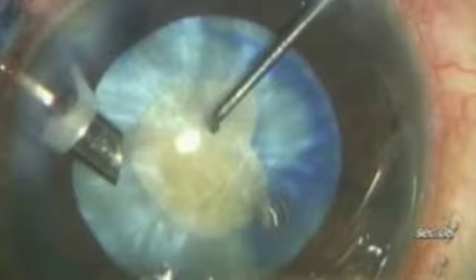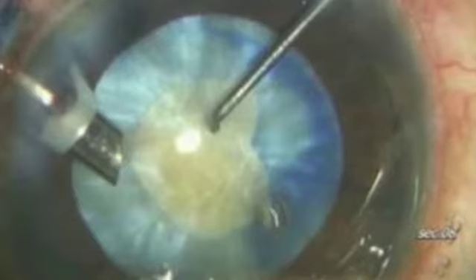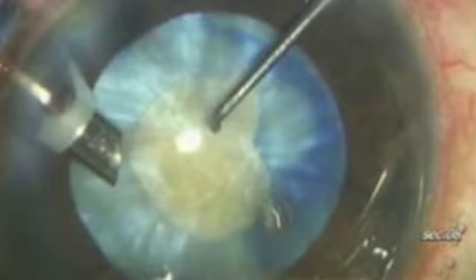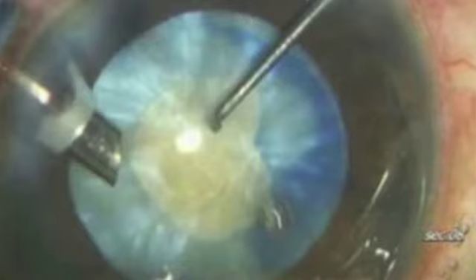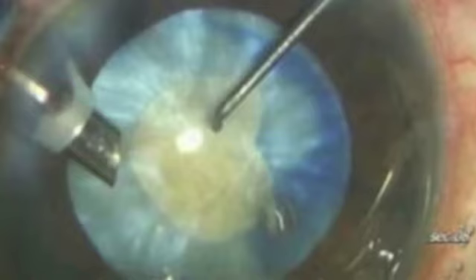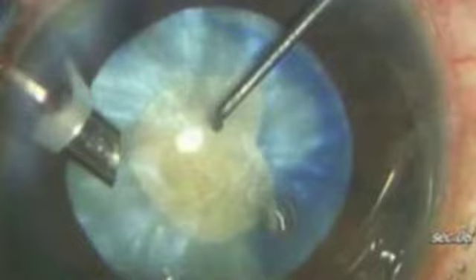I made this video to show you the difference between traditional cataract surgery and cataract surgery using the computer-guided femtosecond laser. In this still photograph I've chosen, you can see a dense white cataract having surgery. The blue is the anterior capsule, and it's been stained with a blue dye to make it easier to visualize. The art of the surgery is to tear a circular opening in this membrane, which is stained blue in this picture. Let me now show you some live video of surgery where the circular tear is being made manually.